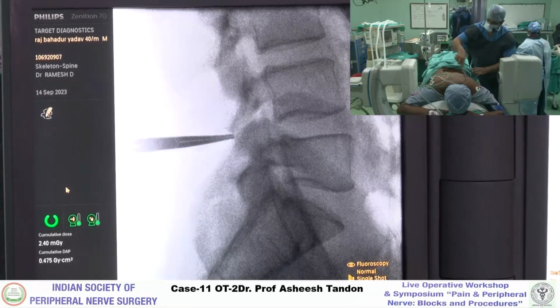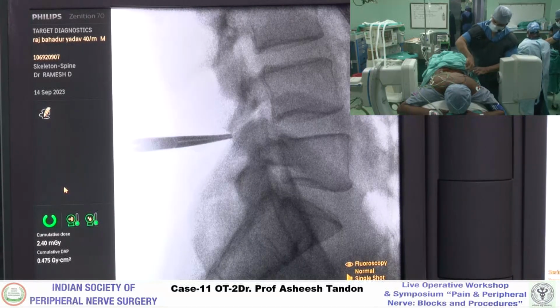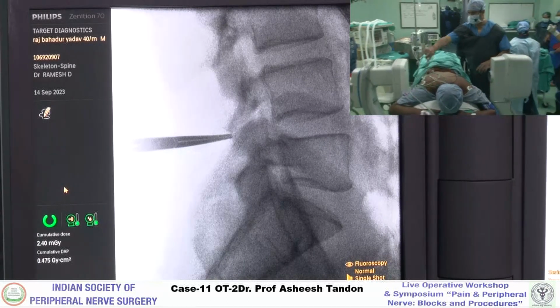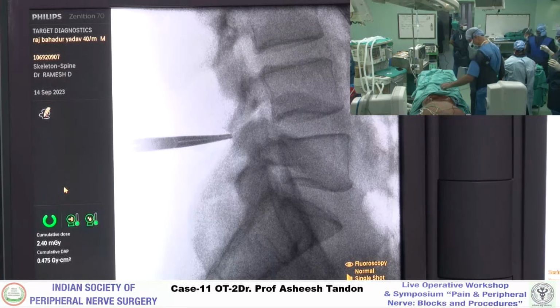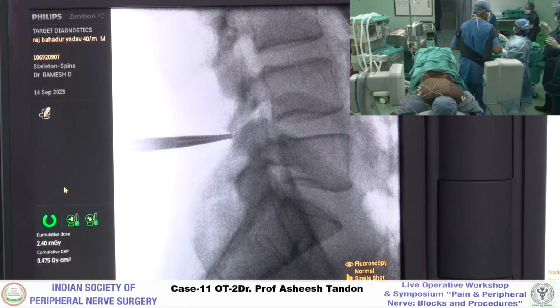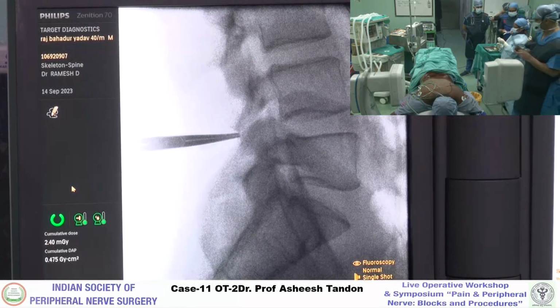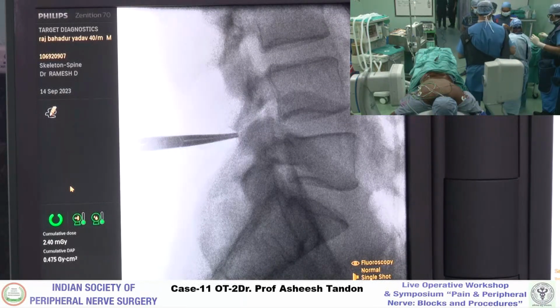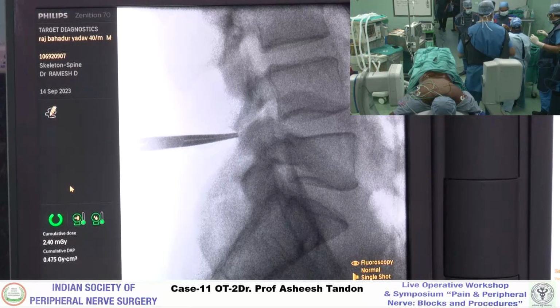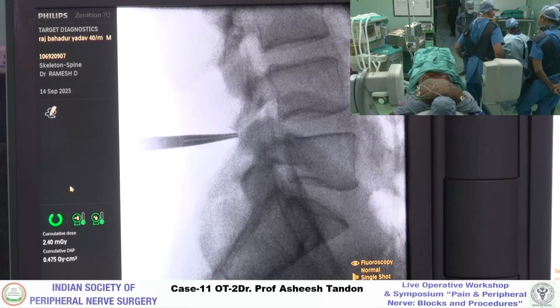I think we have learnt a lot. All doubts cleared? No, I think doubts will always remain, but getting cleared. Scrub. Drape please. Yes, give the local, I'll put it in now. It is very little, sister. That will not work. I will ask him. Let him answer.